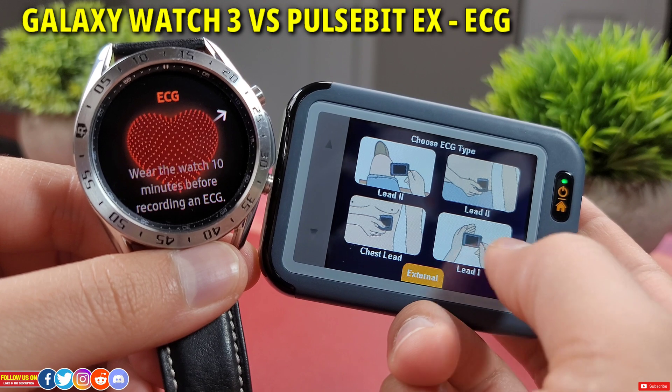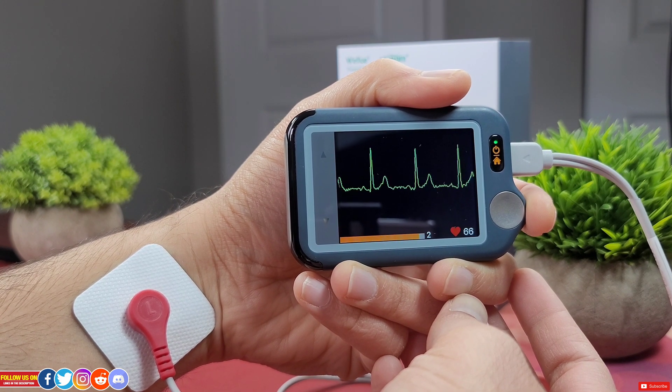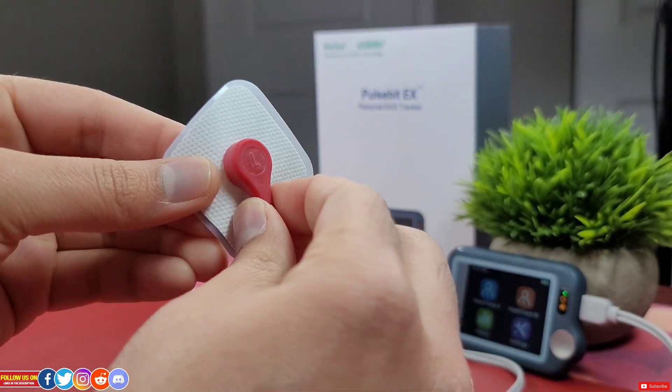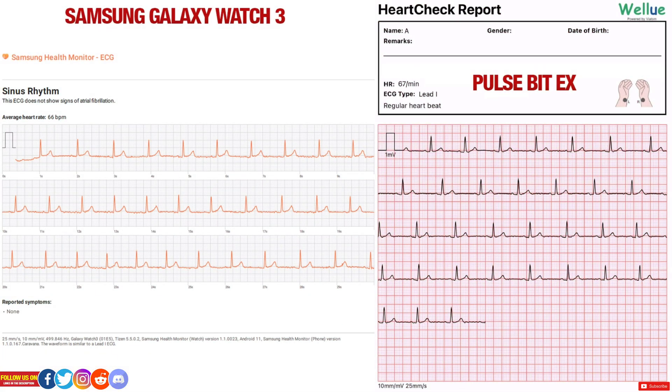Finally, let's compare the ECG reading from the Galaxy Watch 3 with the Pulsebit EX Personal ECG/EKG Portable Monitor, for which I have done a full review linked in the card section and at the end of this video. The Pulsebit EX comes with attachable reusable electrodes for precise measurement, and I personally find its reading super smooth. I used the attachable electrode placed on the underside of my wrist. The Pulsebit EX does not have an option to input symptoms at the end, but there is an option to enter remarks at the top of the reading. It doesn't show how many hertz its sensor runs at, but the graph is super smooth without any stutters — certainly better than the Galaxy Watch 3. I typically use the Pulsebit EX monitor to reference any ECG reading from my other smartwatches, so again I will prefer the Pulsebit EX over the Galaxy Watch 3.